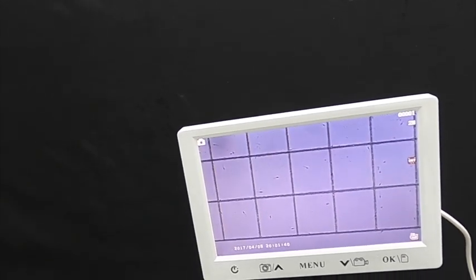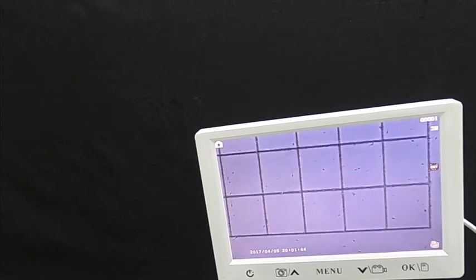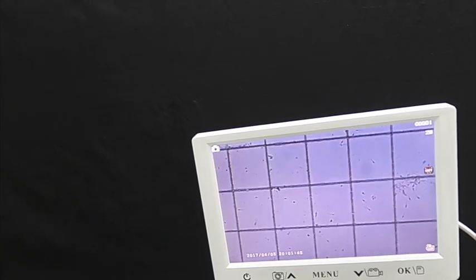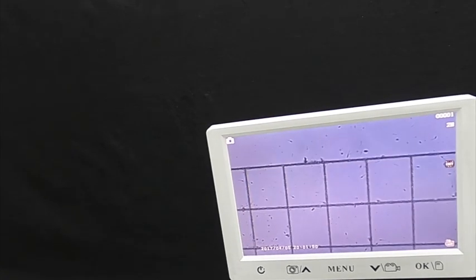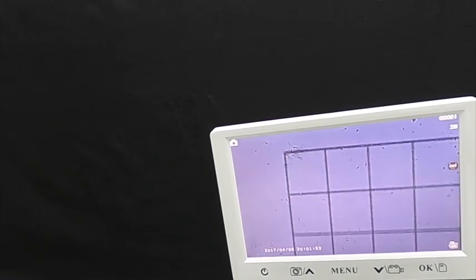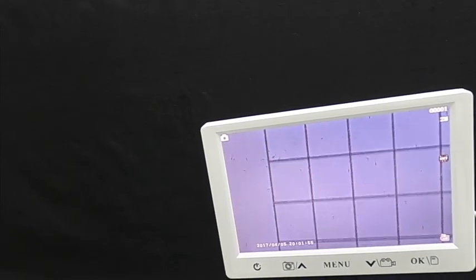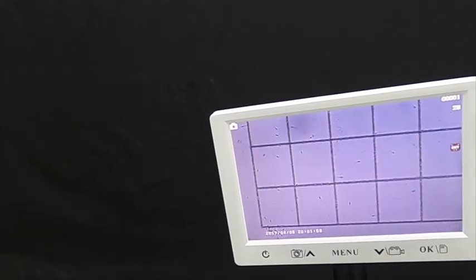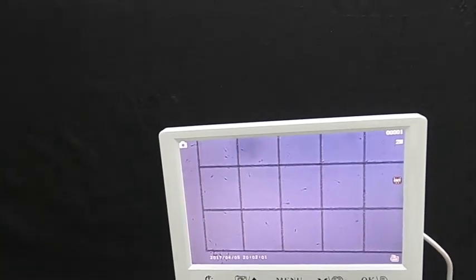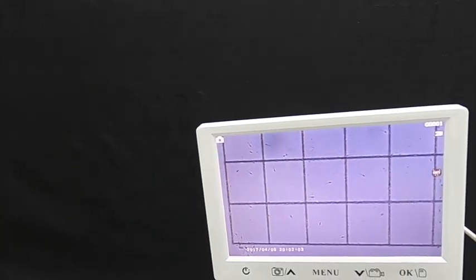To get the best average, we can move the microscope over to a different section. This will help us make sure we've mixed the sample well. Be careful not to count debris as semen. Look for the long tails, the flagella. Here we have good ones in view. We're going to count this up again and average the two counts.